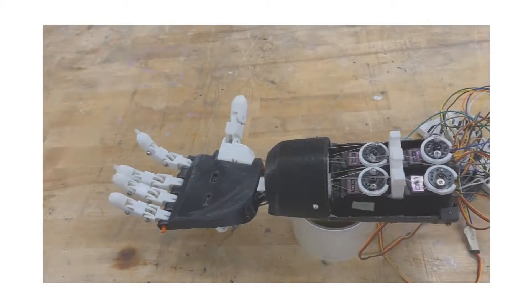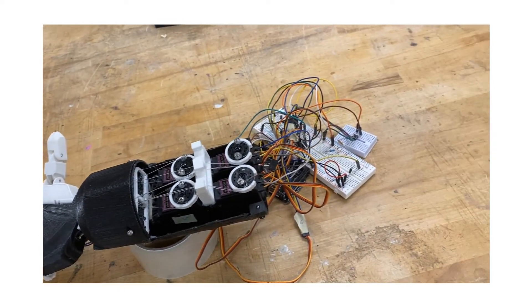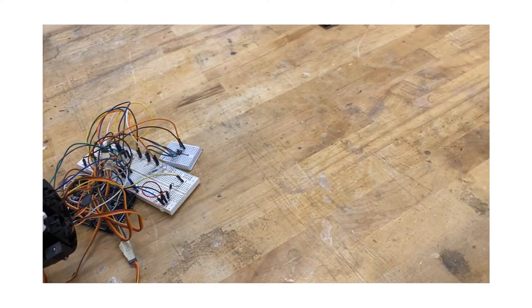That was a little demonstration of how the arm worked. If you'd like to get an inside scoop on how the arm was actually built — the structure of the arm, the code, the circuit design, etc. — do click the link right here, and this will redirect you to another video that goes into the depths of how the arm was actually built, every single bit of it.